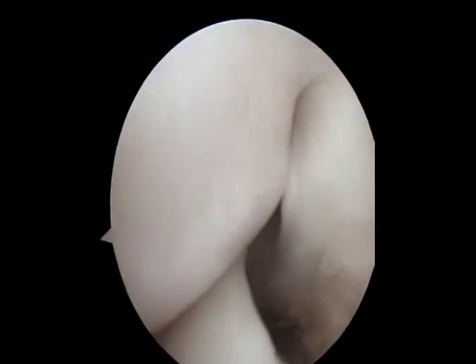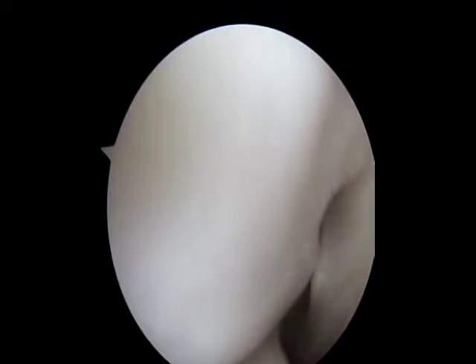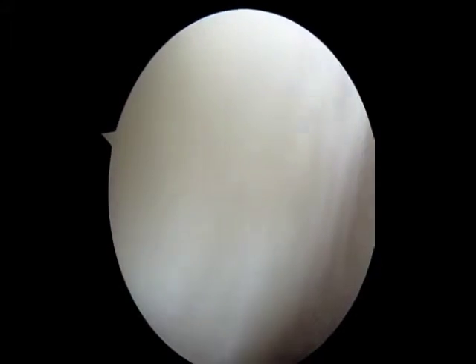After checking the patellofemoral joint, we can typically look down the lateral or outer side of the knee to see the popliteas tendon at the back right, with the meniscus on the left lower side of the screen.